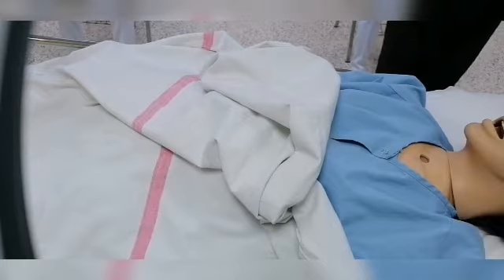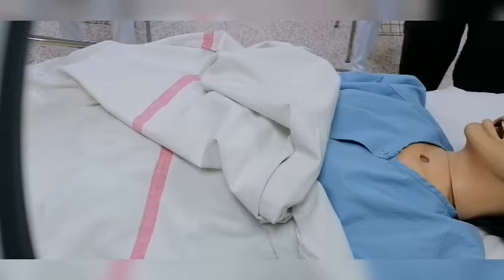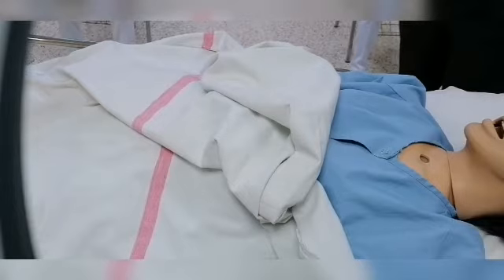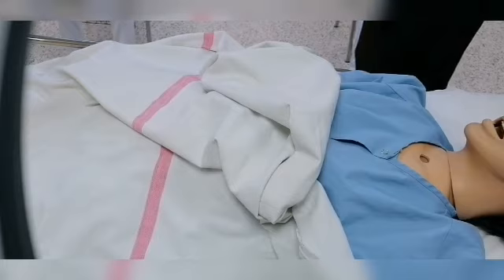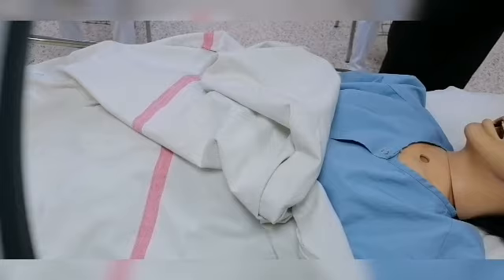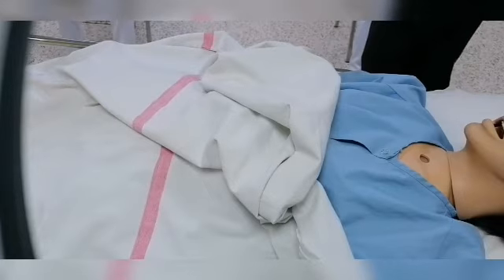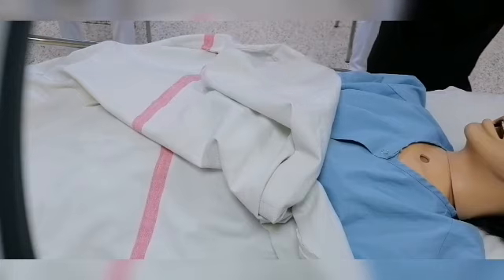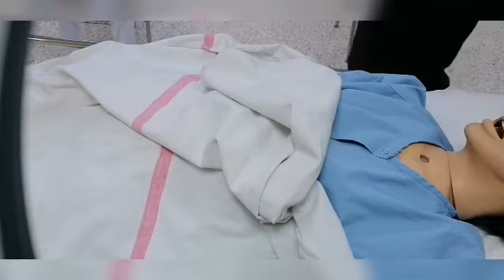The dressing set is different according to the type of the wound. We also prepare the solution which is needed, either betadine, normal saline, or hydrogen peroxide. It depends upon the wound itself, and on whether the client has an allergy. So I have to identify if the patient has an allergy beforehand from his history, from the file.